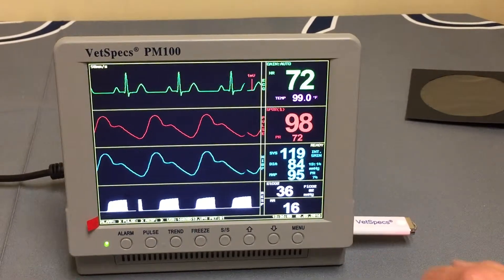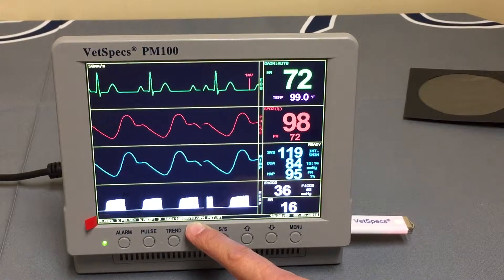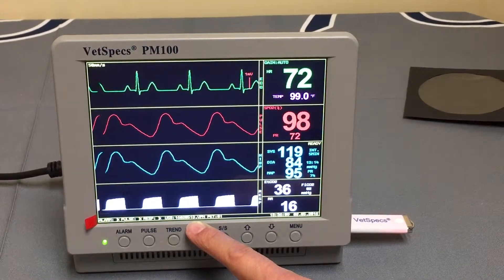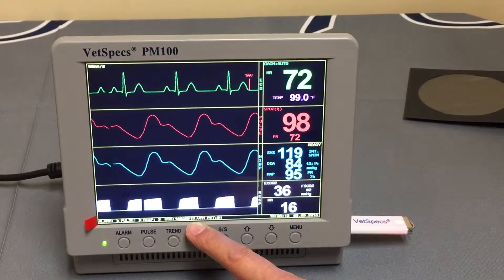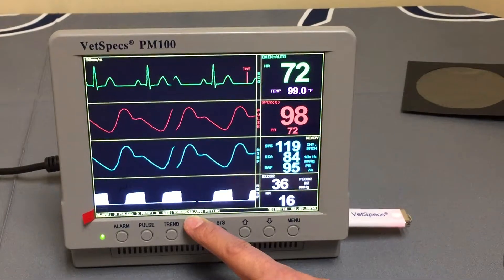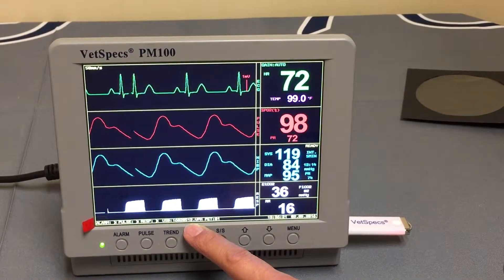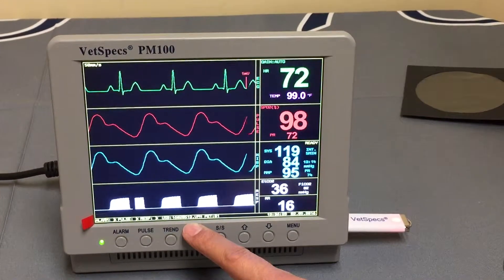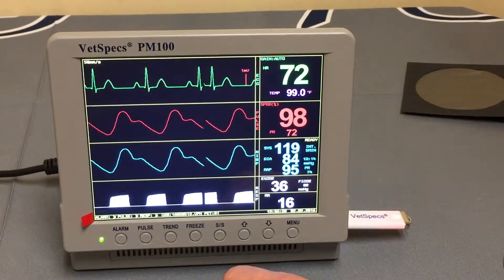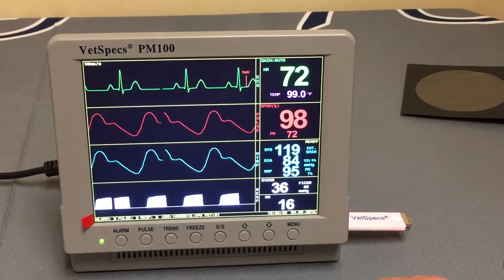One other thing to note regarding the six-second intervals: at the bottom of the screen you'll see that the file number flashes every six seconds. That is helpful for the user to confirm that flashing is occurring. It verifies that the data is, in fact, saving. Look for the file number flashing every six seconds — that gives you peace of mind that the monitor is saving data as it should.